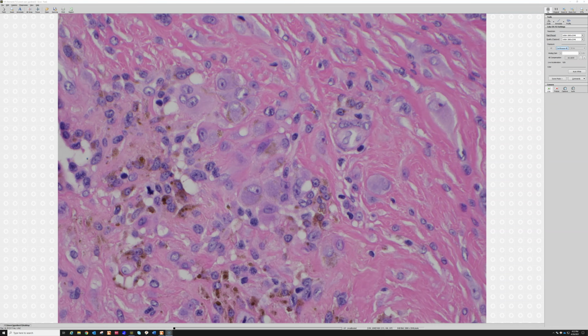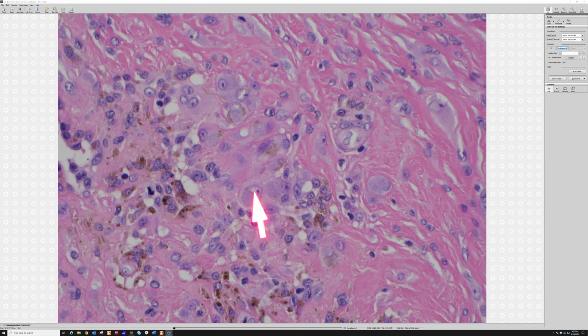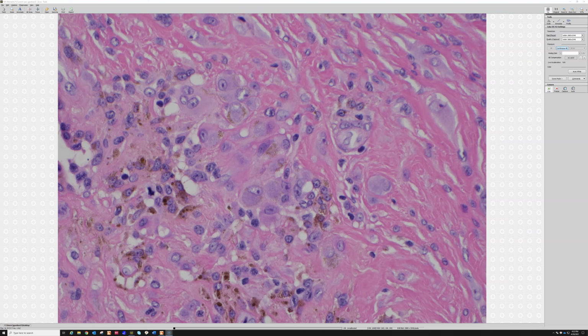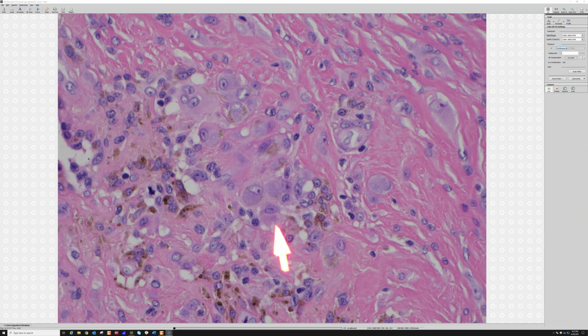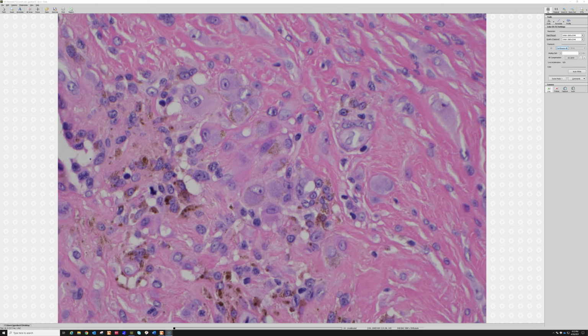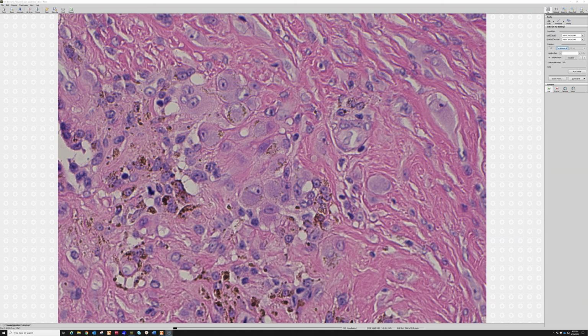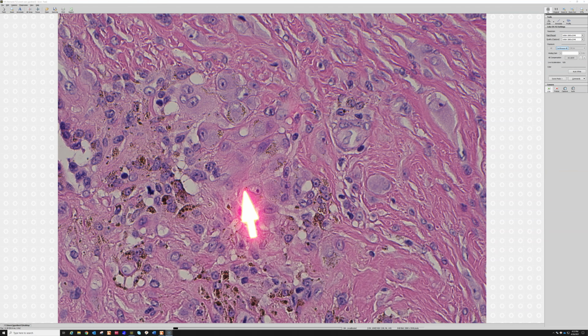So these cells have this large, pale nucleus with a large nucleolus, and then abundant eosinophilic, dense cytoplasm, pink to gray or maybe purple even here, a little amphophilic if you like. And this one has a little ring of hemosiderin around the outside. I hope you can appreciate that. Maybe I'll flip the condenser to show you. Yeah. See, there's this little dusty ring of hemosiderin around the outside.